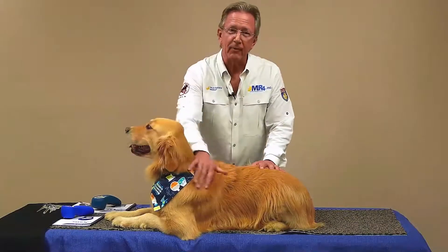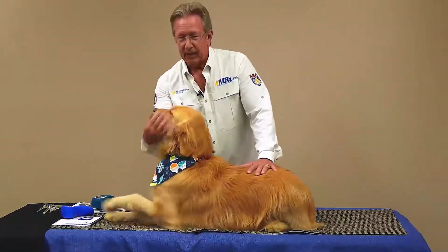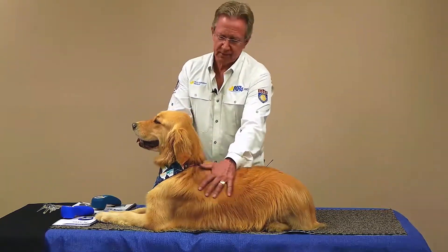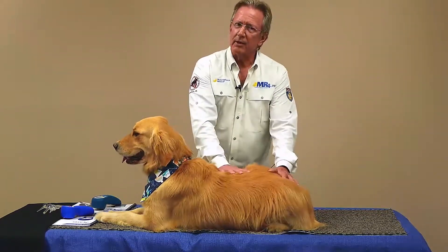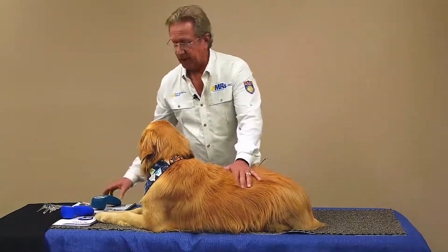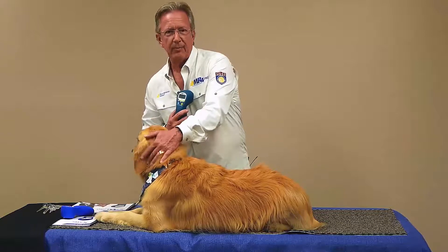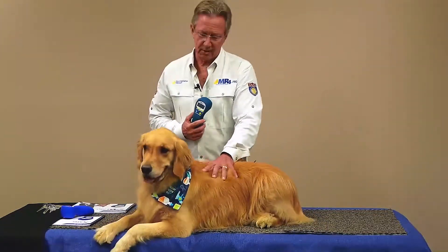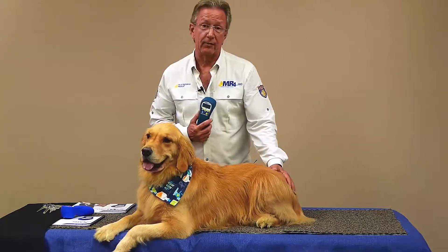Hi, Mark Strong back with you with Multiradiance Medical. Today we have Mojito. Mojito is one of those classic beautiful goldens that you love to have as a family dog, but this dog has a lot of issues as it gets older. Laser therapy is a wonderful way to keep your dog really feeling good by addressing the issues that come along, whether it's an injury or just natural processes like arthritis.